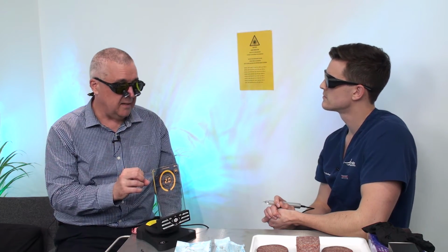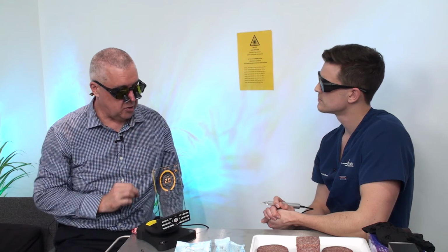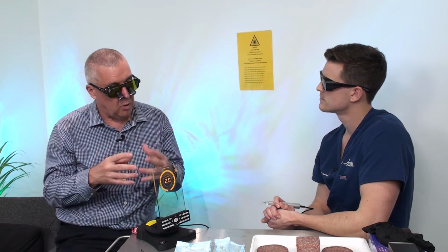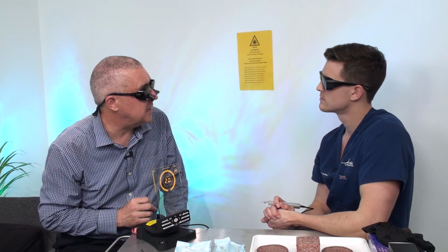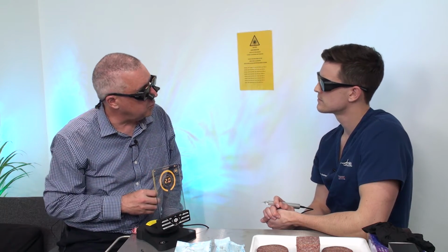So that's where I'm going to set the laser up and just come in and do one or two seconds of exposure and then bug out. But if I'm trying to remove something like a fibroma, or like the gingivectomy case, then I'm going to want to go dual wavelength to get the faster cutting. So it's a question of, are you looking to cut fast, or is controlling bleeding really your take home?